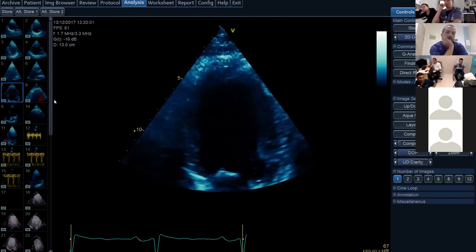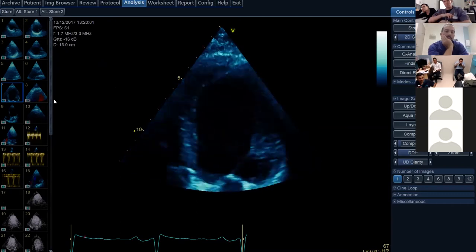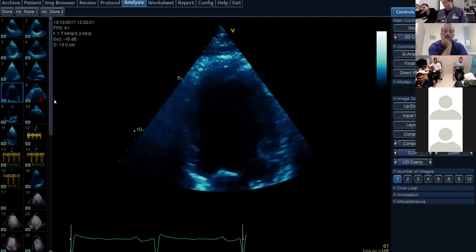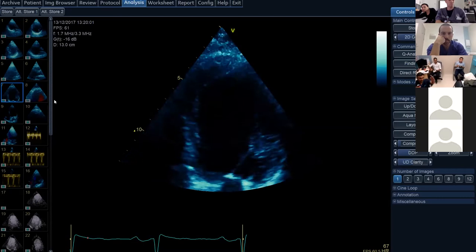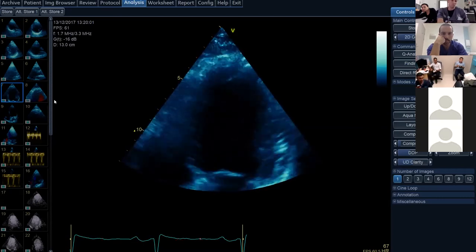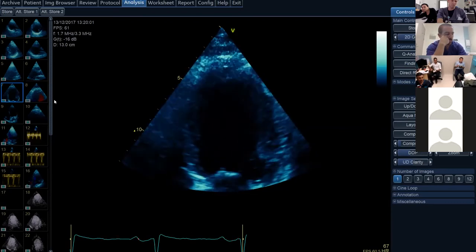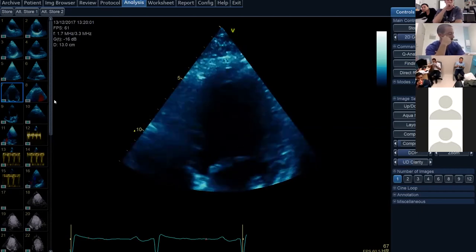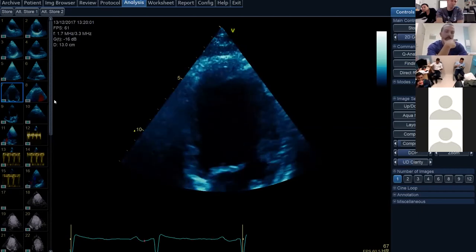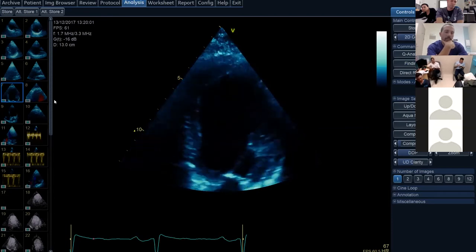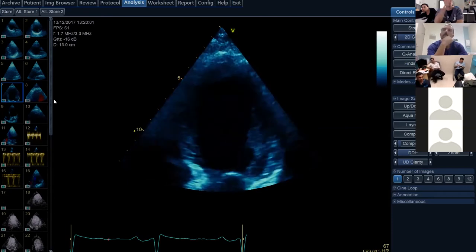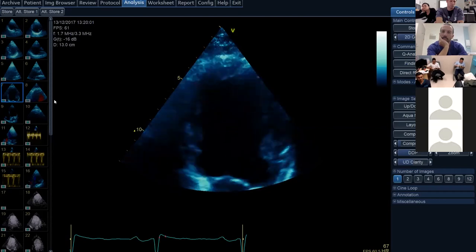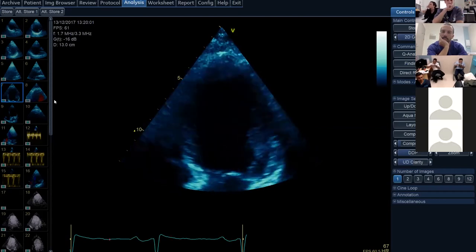Here's an apical four-chamber view focused on the left ventricle. There's moderate LV systolic dysfunction. The apex is akinetic. The anterolateral basal region is contracting a little and the septum is doing something, but I'm concerned about the apex. In this setting where the LV appears quite dilated, the apex ought to be more closely investigated for thrombus, given that segment appears akinetic.